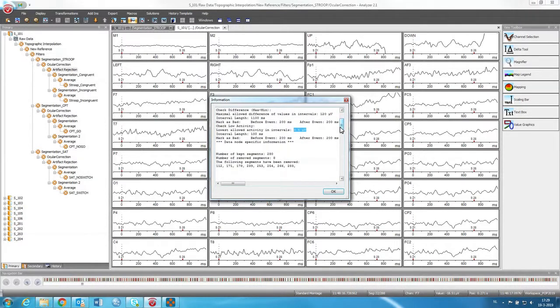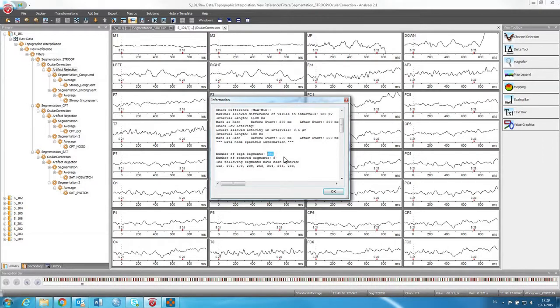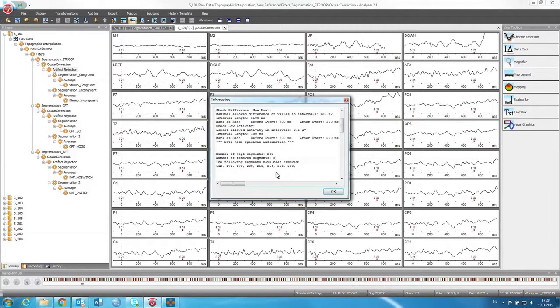And after all of this, we can see that there were 280 kept segments. So that means, if you remember correctly, there were 288. So there are 8 removed segments. So that's pretty good that only 8 segments had to be removed.